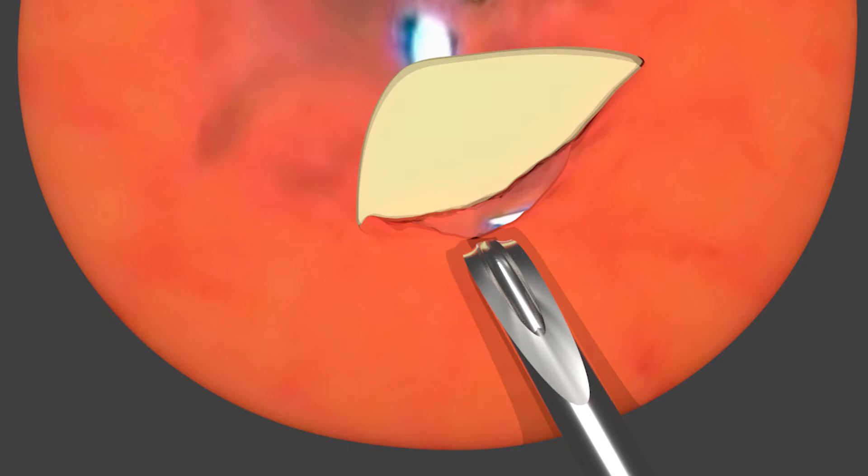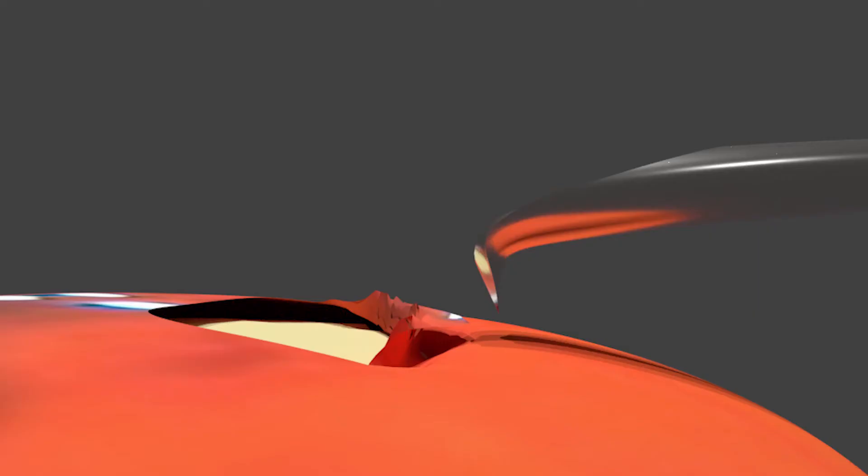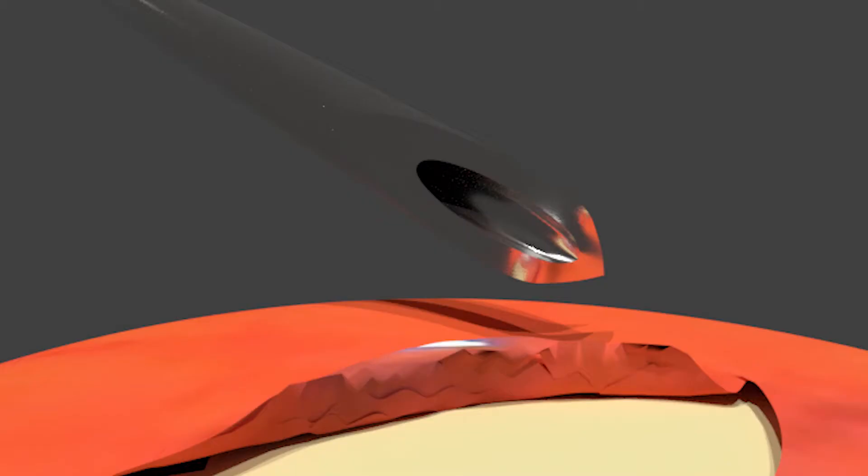There's another problem you cannot see from that image. In this next one, you can see that the tip of the cystotome was not even engaging the lens. That is the main problem — we're too high, or too far up in the anterior chamber, and the tip is not engaging the tissue. The next issue, occurring in that 30-second window where they were having trouble converting the rhexis to the flap, is that the cystotome is twisted so the needle is actually pointing to the left. Because it's pointing to the left, we're decreasing its ability to interact with the flap. This other view shows that not only is it above the tissue, it is also turned — the combination of those reduces even further the ability to grasp the tissue.